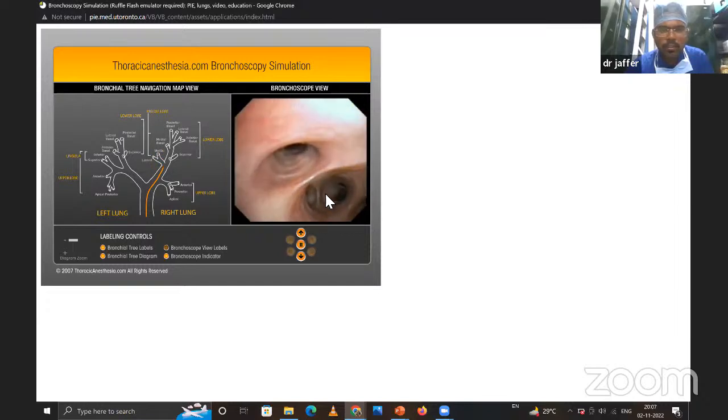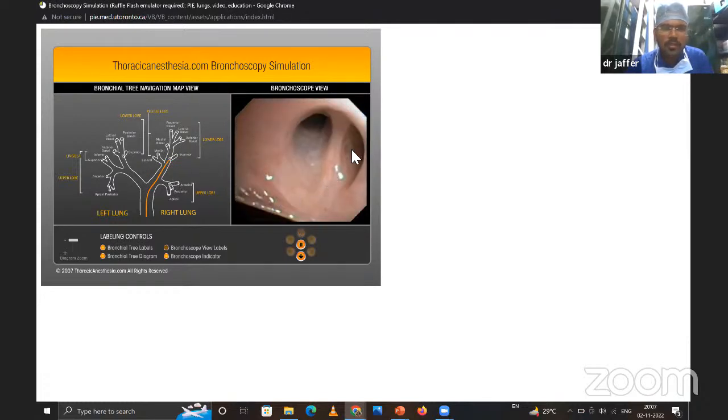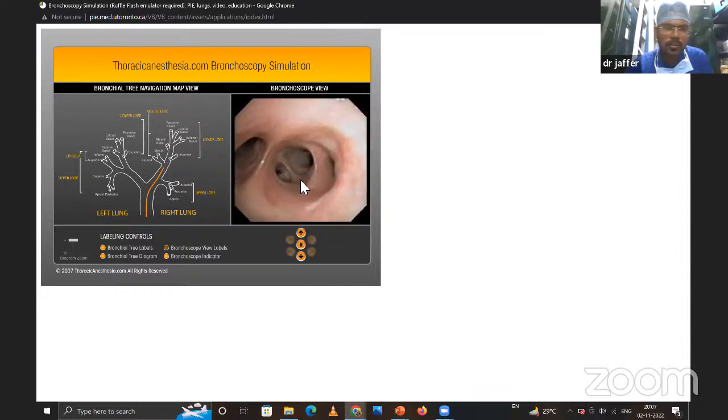and this is the RC2, which divides the middle and lower lobe bronchus, and the lower lobe has got the superior segment. Yeah, this is superior. So the superior part of the lower lobe is always at the posterior. So this is the main area for aspiration to occur. So we need to look at that part. So superior is very important.